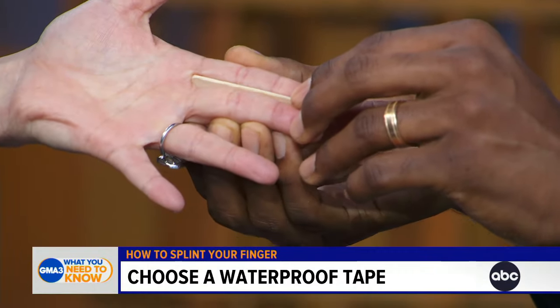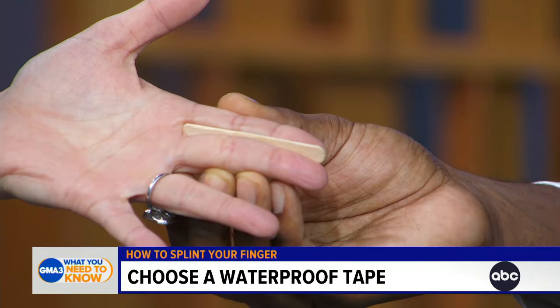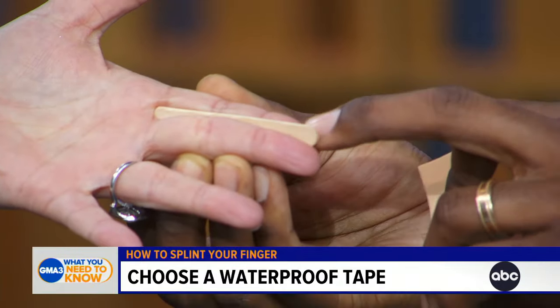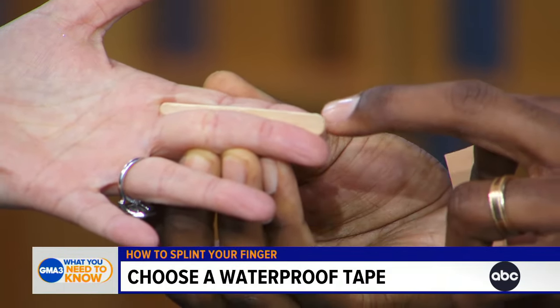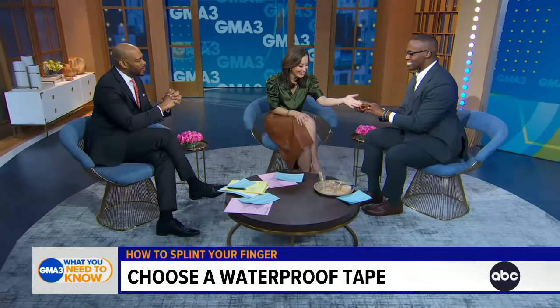Another way you can do it is to simply put that piece of hard material between two fingers and tape both fingers together. It's really simple — you just want to make sure your finger stays in the appropriate position. After you tape it, you want to check what we call capillary refill to make sure you've got good blood flow and it's not too tight. I've definitely been a victim of tying a splint a little too tight on myself and woken up with a painful blue finger. So don't do what I did — you don't want to lose the finger.